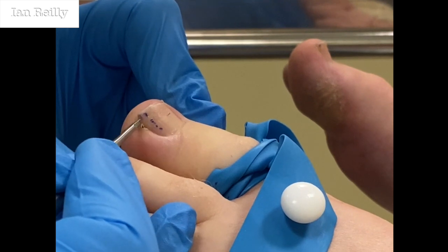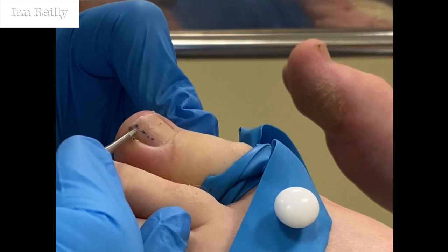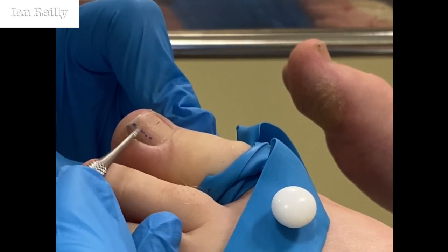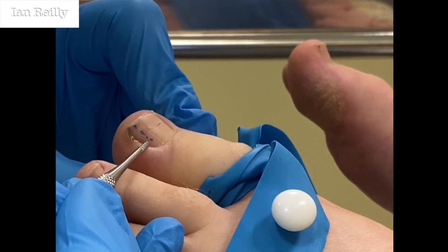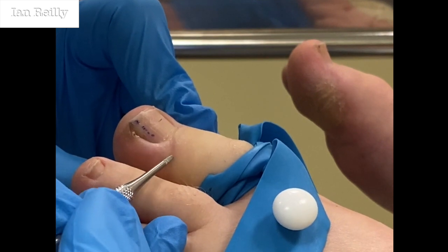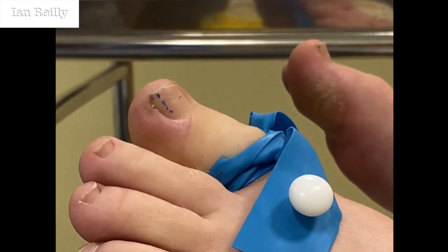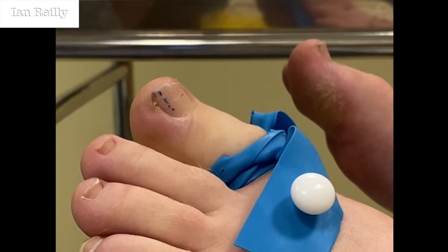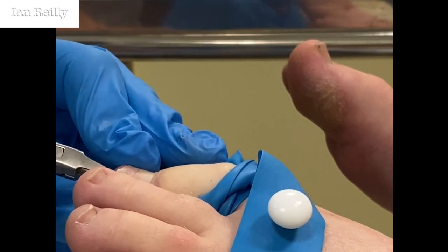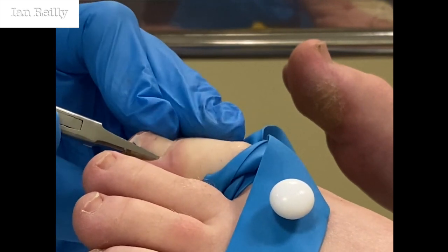The nail itself is really not too much the problem. I will actually, just for belt and braces, take a little section of nail out. This is when Sophie was in a few days ago. I just kind of marked up where ideally you would do a PNA with phenol. So I am actually going to take a little section of nail out. Now you can just do that hemi-VANDENBOS type procedure, and you can do it plus or minus nail. Various authors, having looked at all the literature, have tried it with and without. I think there's an argument in this case just to decompress the nail and take that out so that the nail itself is gone.